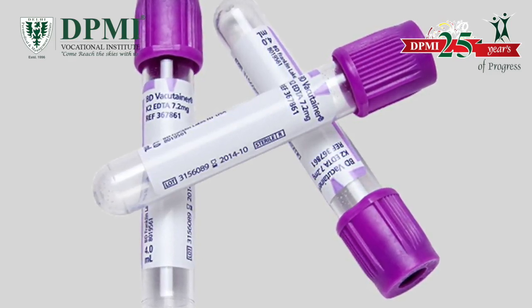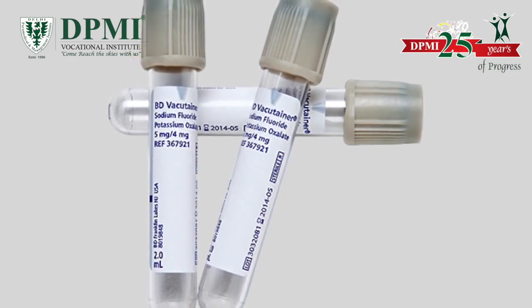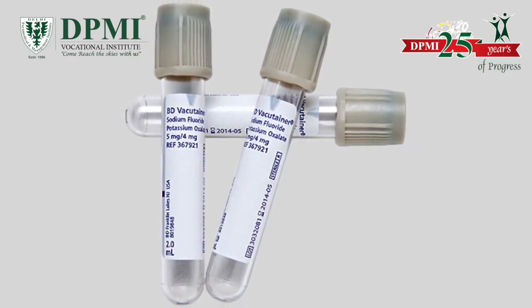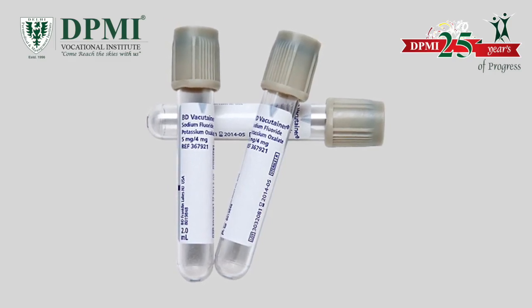Basically, lavender top is best for hematological tests. Gray top. These tubes have sodium fluoride and potassium oxalate. Sodium fluoride acts as an anti-glycolytic agent; thus, these tubes are used for blood glucose determination.